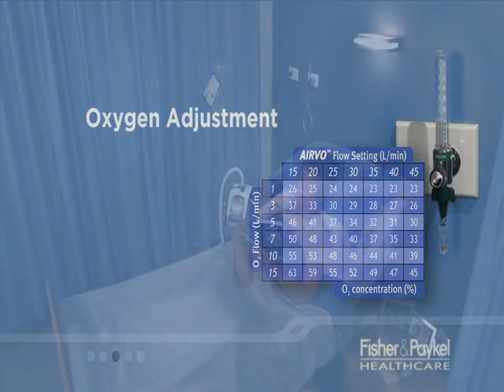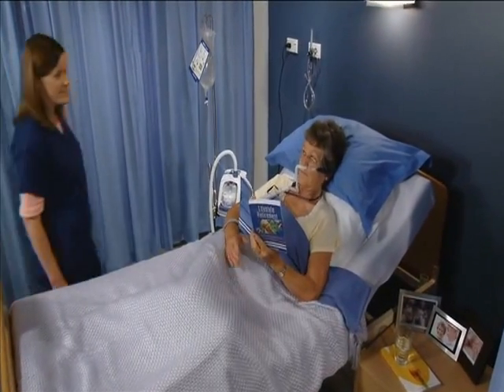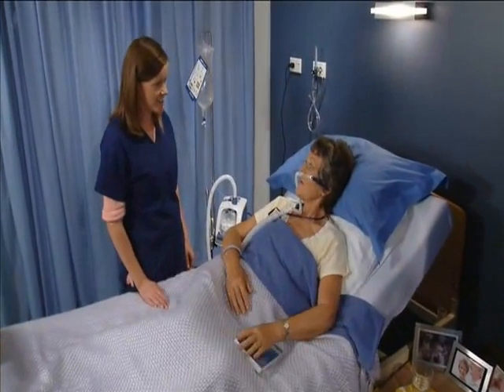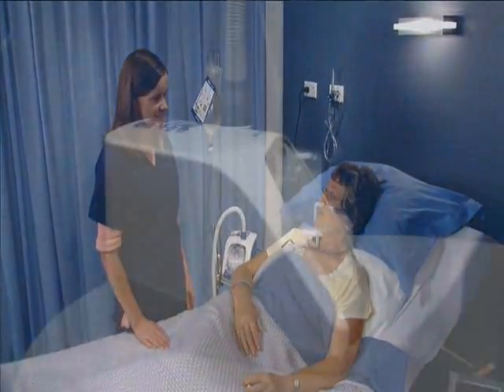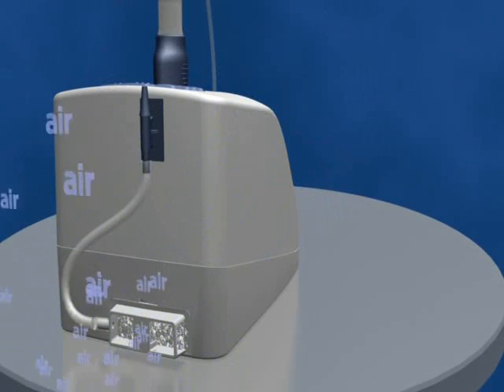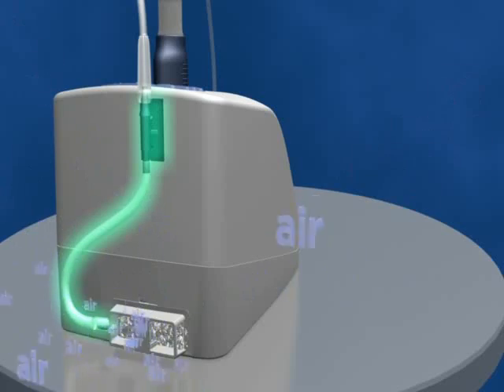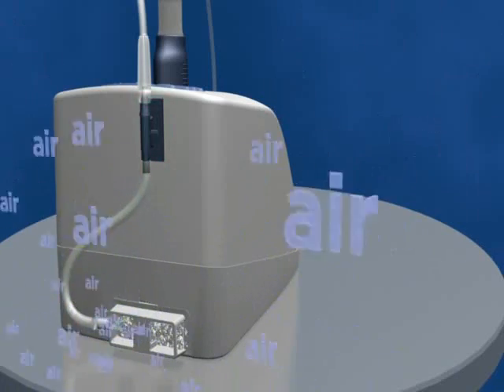In the previous chapter, we prepared the AIRVO to provide humidified room air. Now, let's look at setting up the supplementary oxygen supply. Room air has an oxygen concentration of 21%. However, we can increase the level of oxygen delivered to the patient using the oxygen inlet extension kit. The extension kit adds oxygen at the inlet port on the back of the AIRVO. This supplementary oxygen mixes with room air before being filtered, warmed and humidified inside the AIRVO.